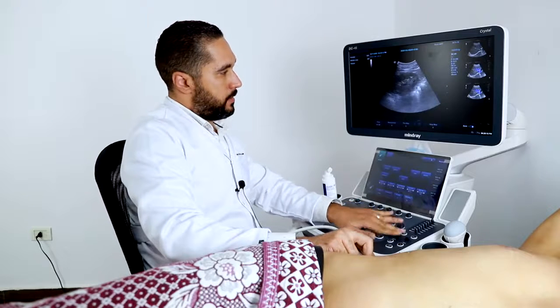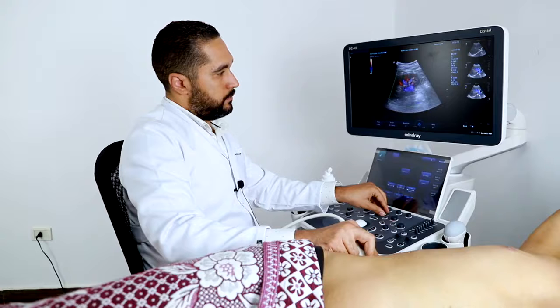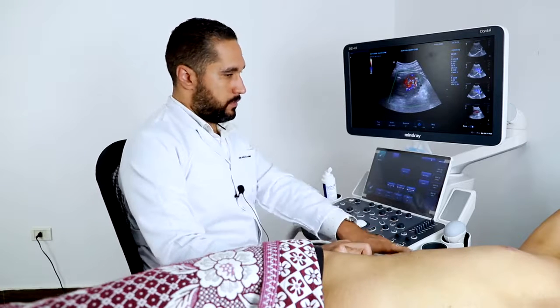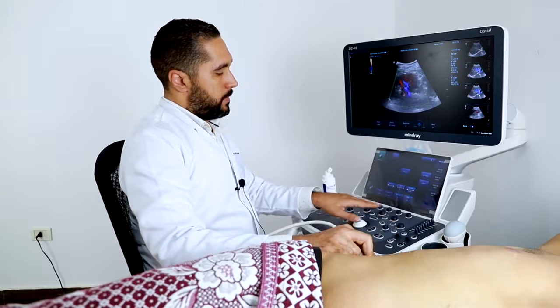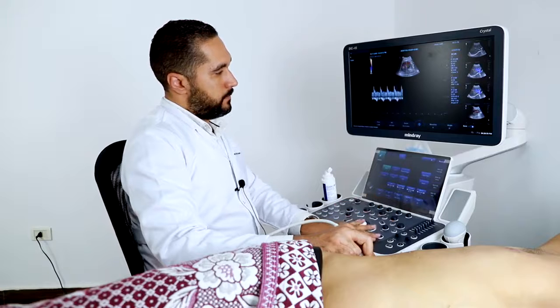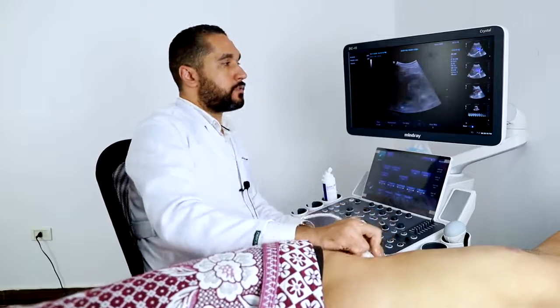I'm going to add the color Doppler on the kidney. I'm also going to add the pulsed wave on the near renal artery. We have a good flow of the renal arteries. This means the sensitivity of the pulsed wave is very high, like the sensitivity of the 2D resolution with the single crystal probe.